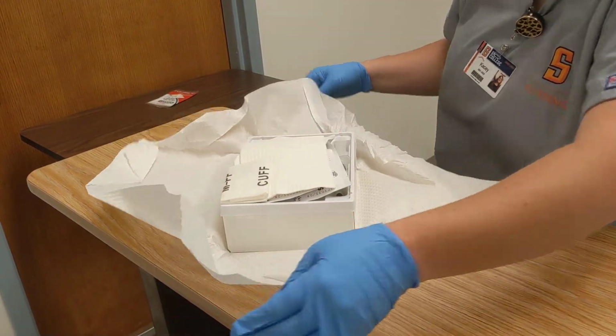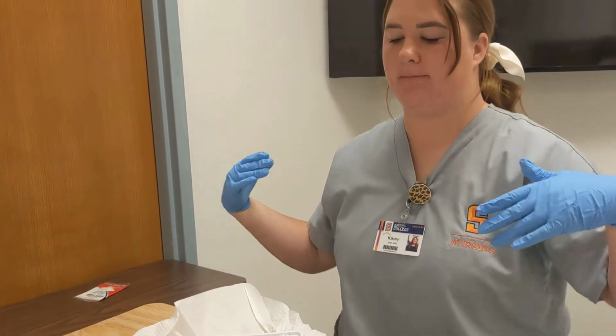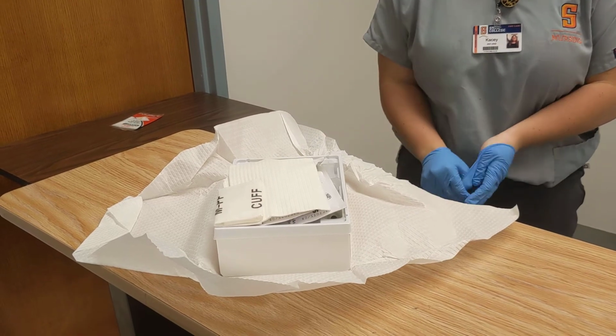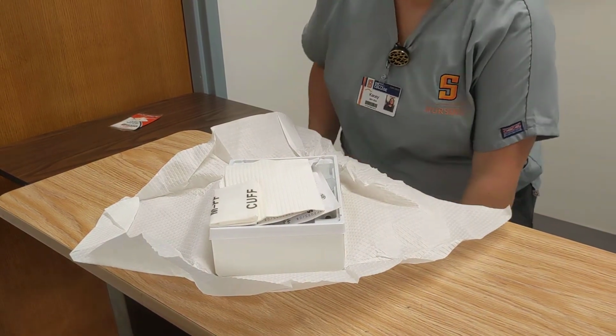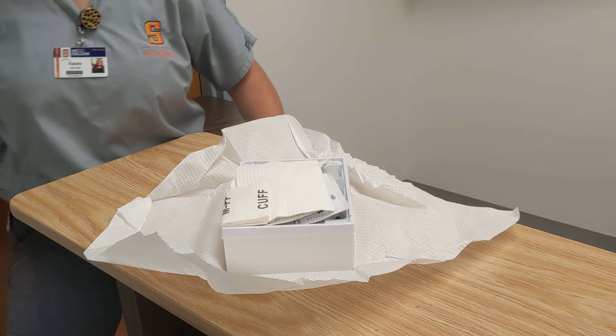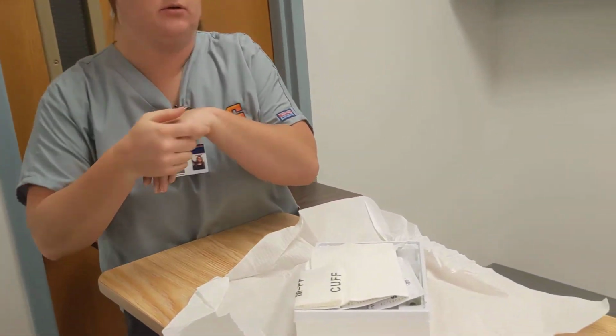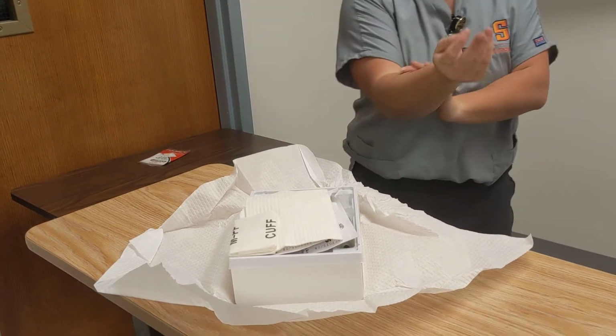This way so I don't accidentally touch it with my body. So now we're going to put our sterile gloves on. So I'll remove these gloves. I'm just gonna put some hand sanitizer on to do my hand hygiene, and then I'm going to put my sterile gloves on.